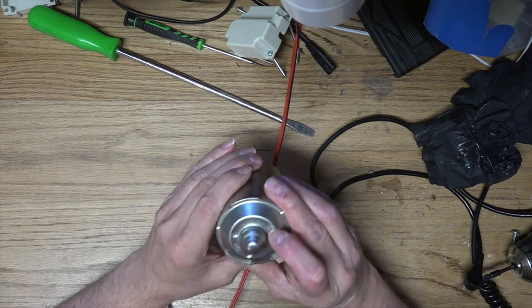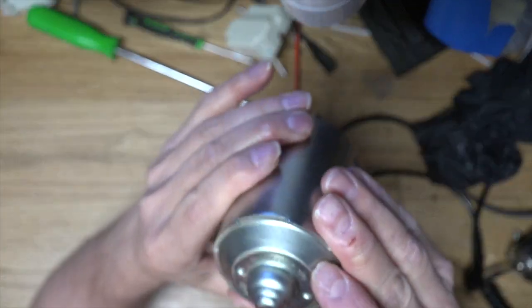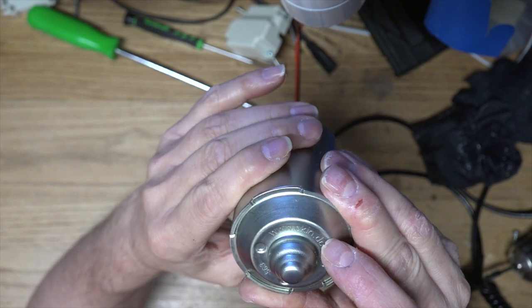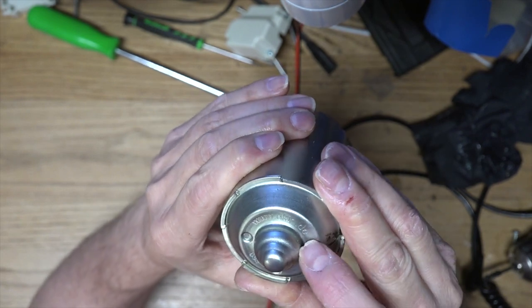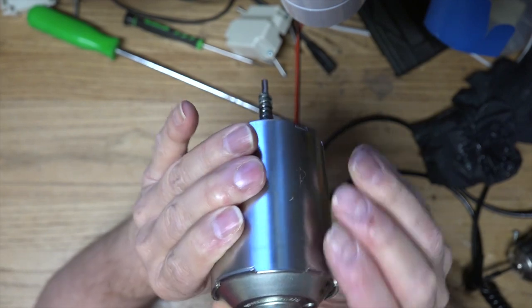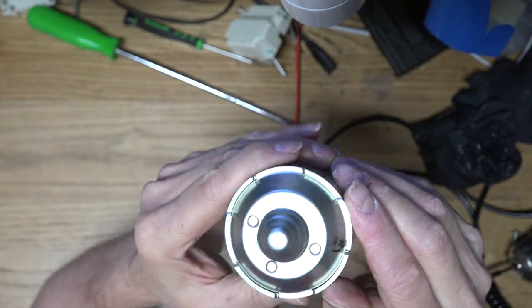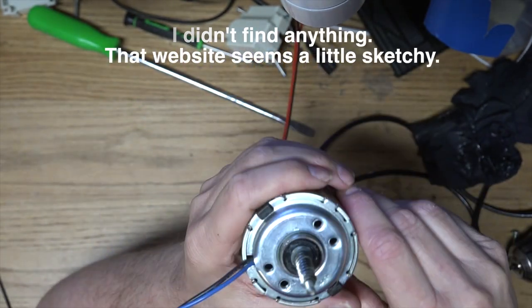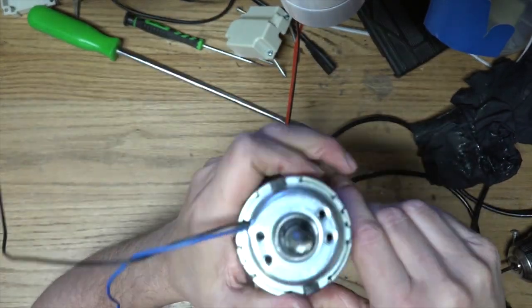Oh, apparently it's from Germany. This says on the back here, I think I disconnected something. Yeah, www.okin.de. So it must be from Germany. This is a model 563. I'll have to try looking that up on the web. I mean, that is a hefty motor, that's for sure.